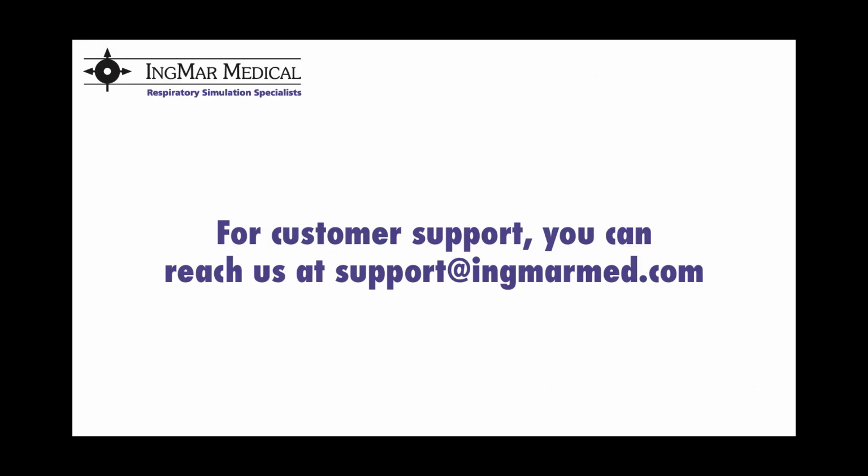In fact, we have a technical support team here that really deals with a lot of those connectivity and setup challenges that customers may have. So please feel free to reach out to us directly if you have further questions and would require further assistance getting the specific setup that you need. Okay, it looks like I answered your question there.